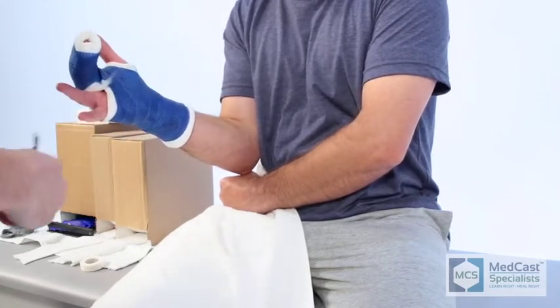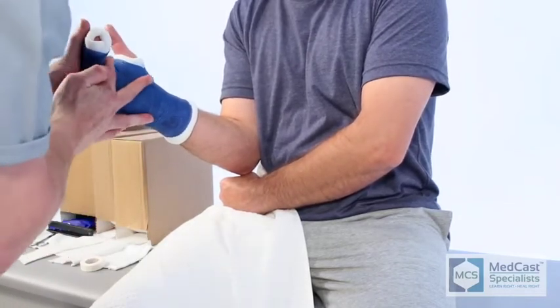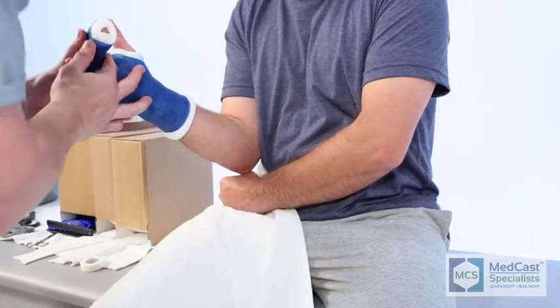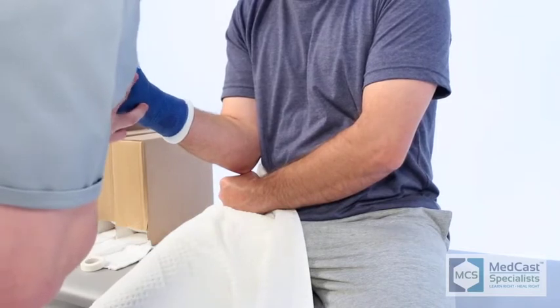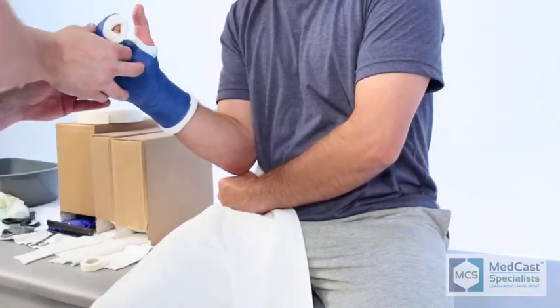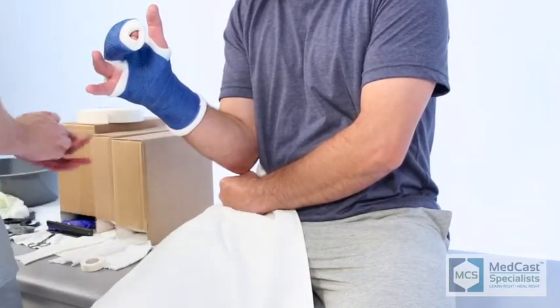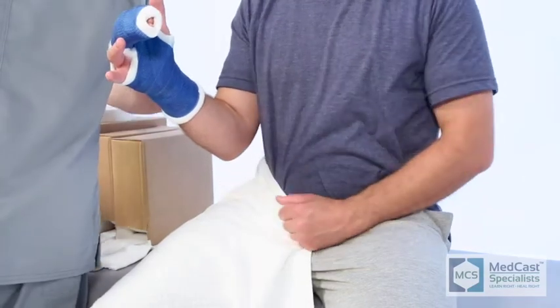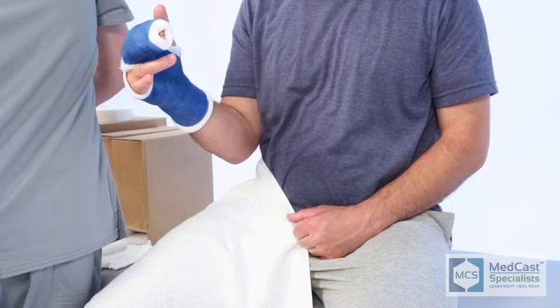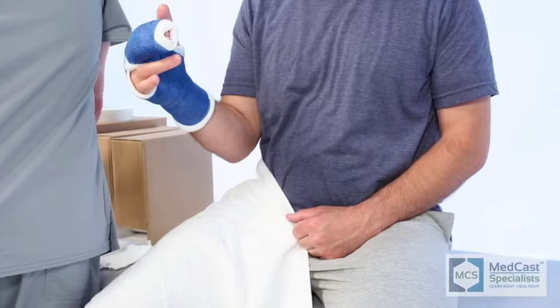It's really important to get a good mold on this cast. So through the palm, through the fingers, you're going to constantly want to keep molding it so it fits appropriately. Because it is a little bit shorter than a normal short arm cast, you do want to have a good appropriate mold in the volar part and also in the distal end of that cast so that it doesn't roll from side to side. Also look on the distal end of the cast here where the second and third digits are incorporated in the cast. He has it nice and flattened out so that those two fingers are not squished or crunched together. You want to make sure that there's adequate space on those digits.